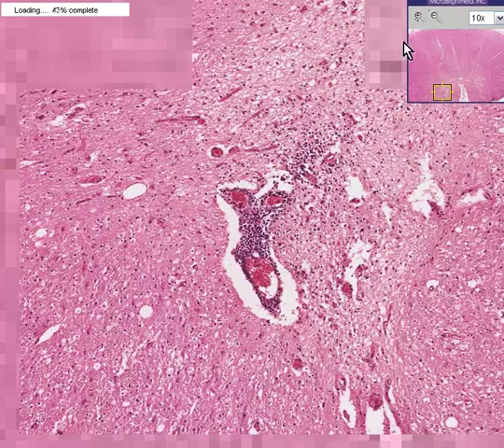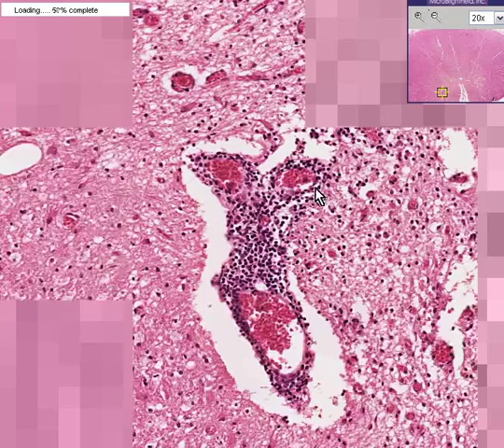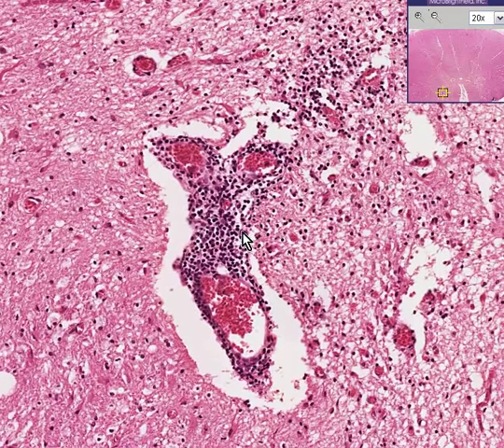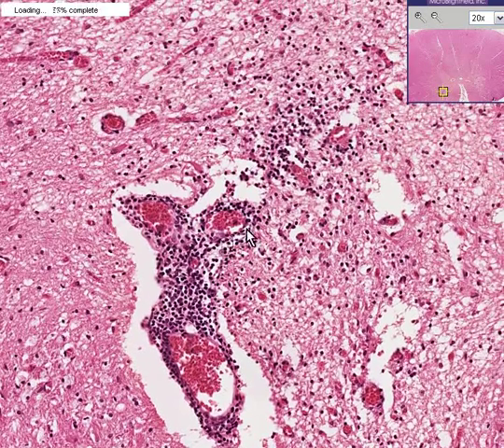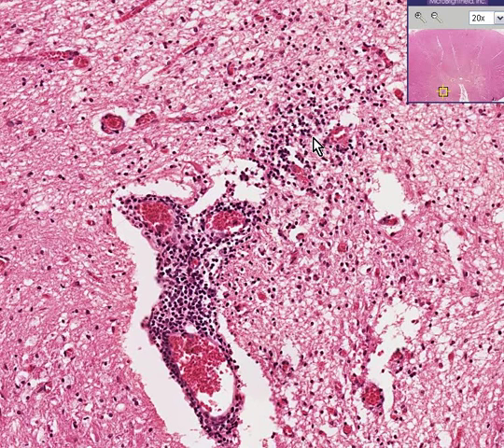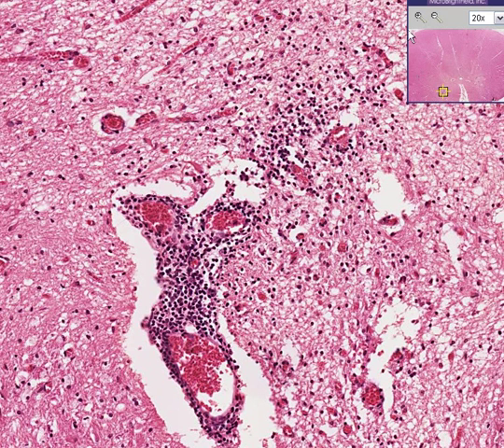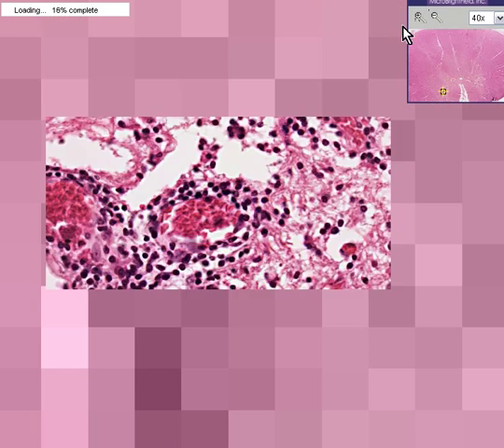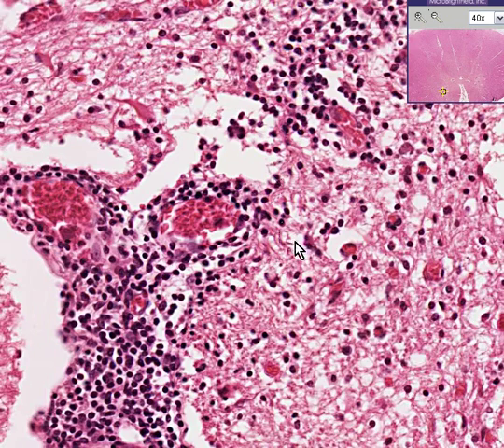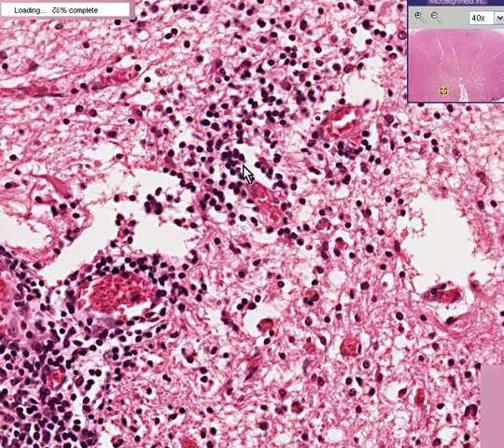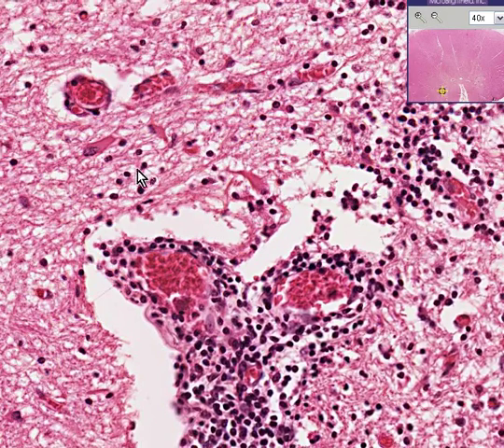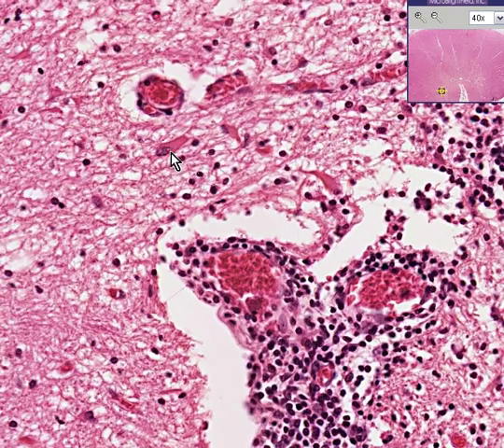You can see that there are some inflammatory changes. They are chiefly perivascular but they also involve the gray matter of the spinal cord itself. There's an inflammatory process going on here, and although chiefly you can see a reaction of glial cells as part of this inflammatory process, please note that there are occasional neurons which are being involved also.